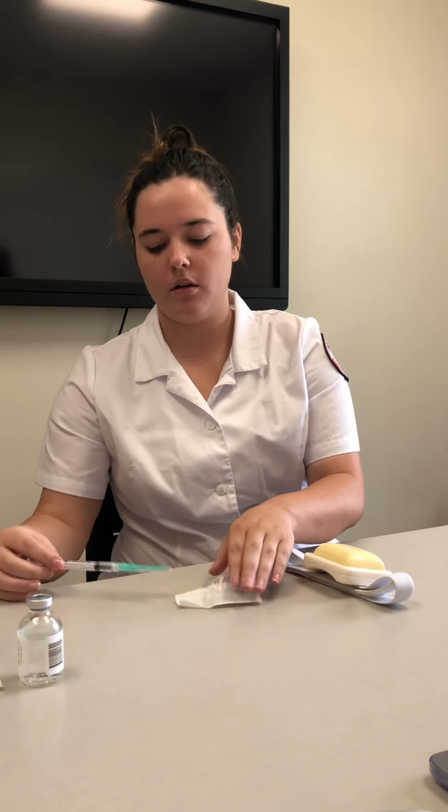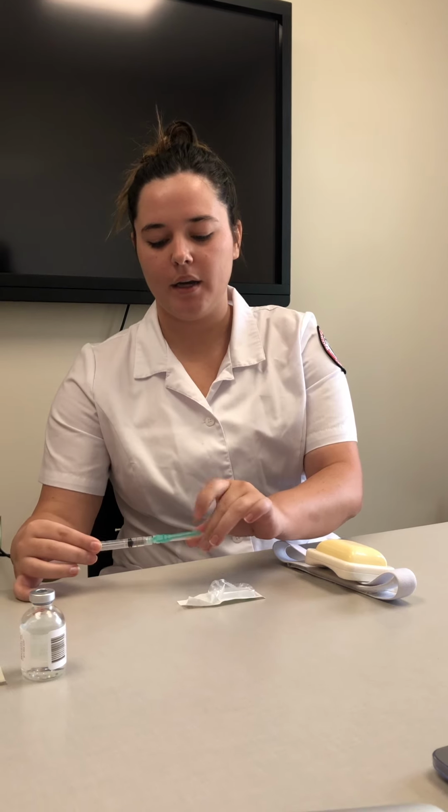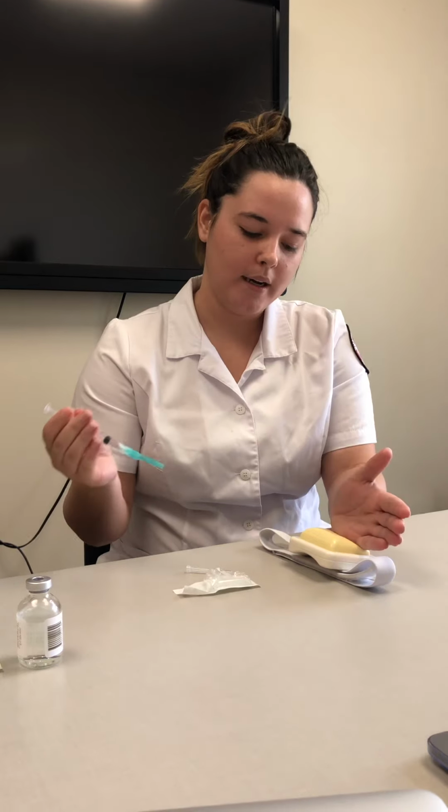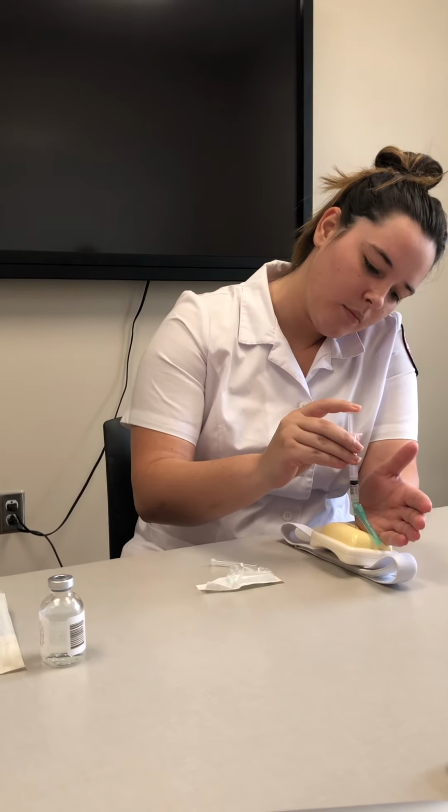And then I'm going to carefully uncap my needle and do the Z-track, putting it in at a 90-degree angle, and I'm going to inject this at 10 seconds per milliliter. So that's slowly. And then after the medication's completely in, I'm going to hold it for 10 seconds and then take it out.